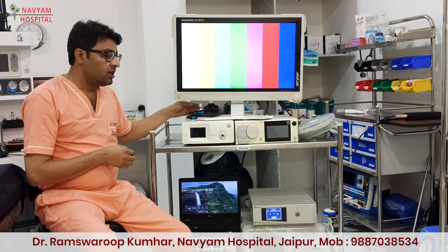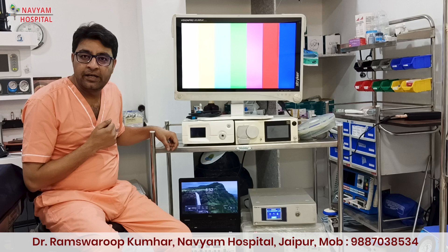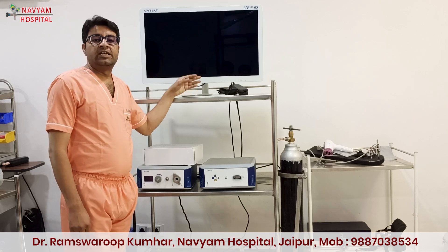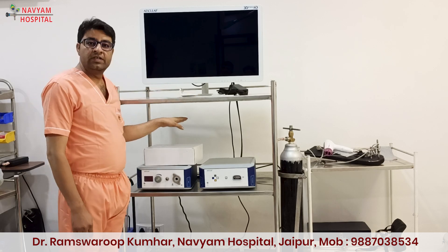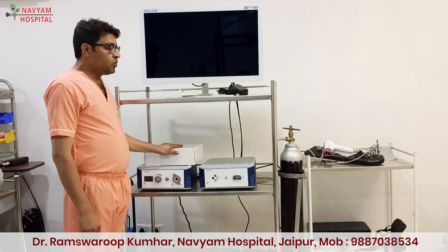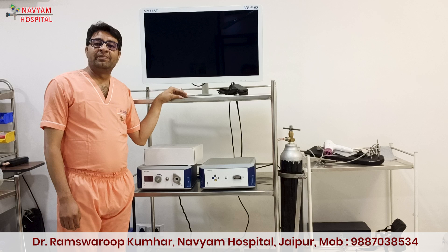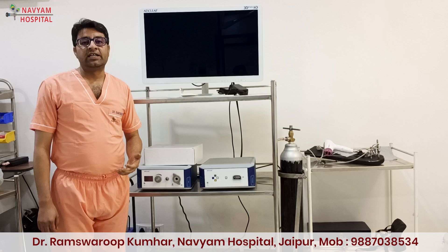Later on, if you want to upgrade yourself according to your time and need, you can upgrade everything. Just like with the passage of time, when you have sufficient patients, expertise, and money, you can upgrade your system. Just like we have upgraded our vision system to 3D laparoscopy and I am very happy to do my whole work in this 3D. This 3D system has increased my confidence and surgical safety. But I also use my 2D setup during freelancing and they are doing very well. So friends, if you want to set up your own setup, don't worry — go ahead and start. Best of luck. Thank you very much.